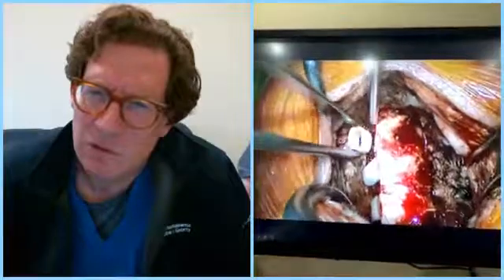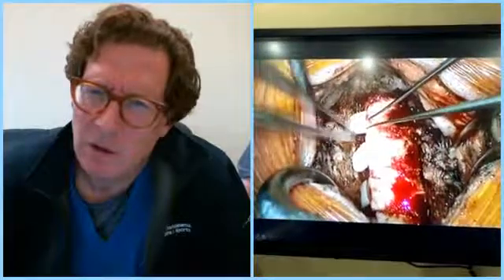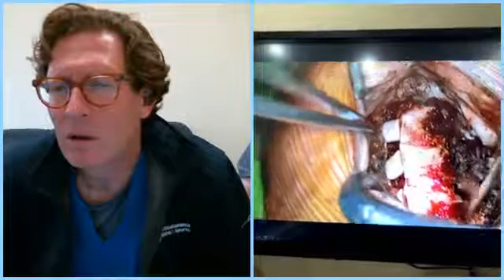So what we've done essentially is just rebuilt the spinal channel in a way this will just regrow, and now the bones are just bigger. So instead of having stenosis, the spinal canal is bigger than it was when you're born. Okay. So that shim is like a bone dowel.